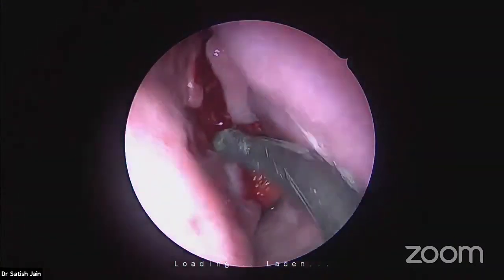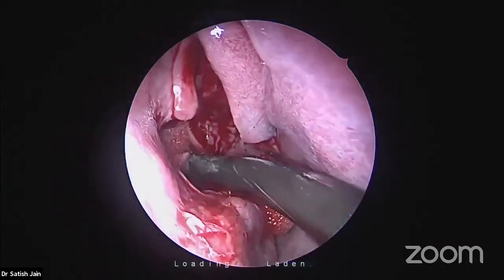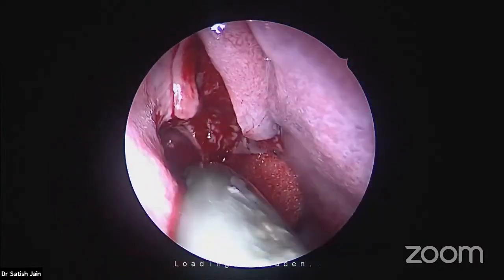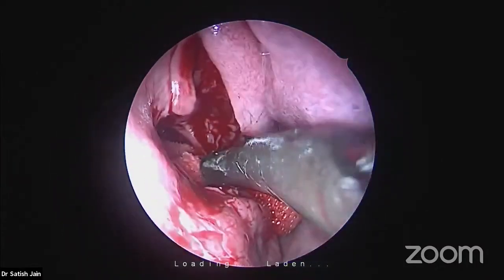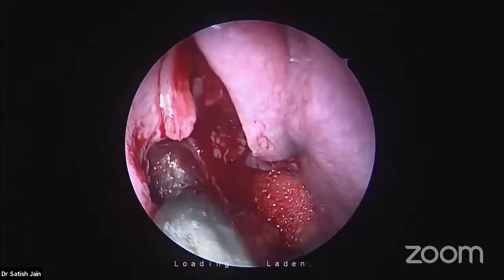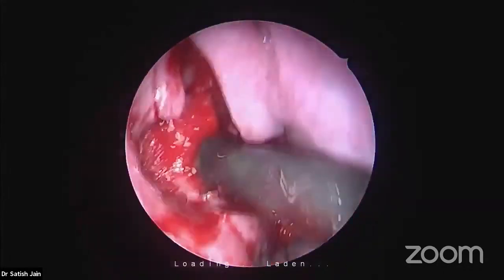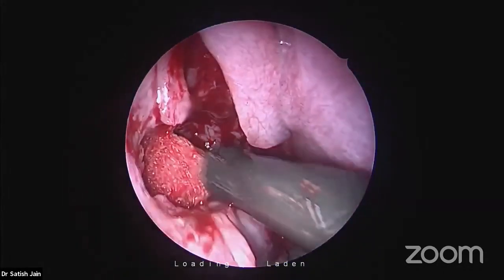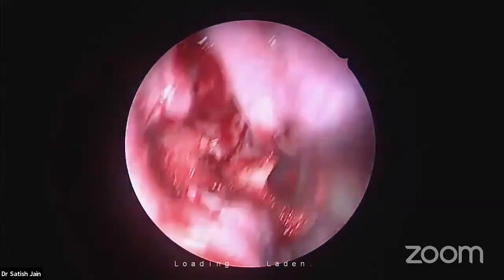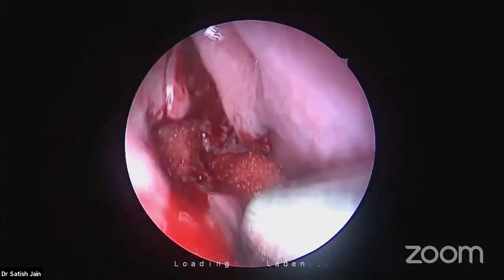What about the superior turbinate? Superior turbinate, again the lower one-third, not entirely, because removing the lower one-third improves access to the sphenoid sinus. Otherwise, the superior turbinate doesn't limit access to any other sinus. Only the lower one-third, which we always remove.